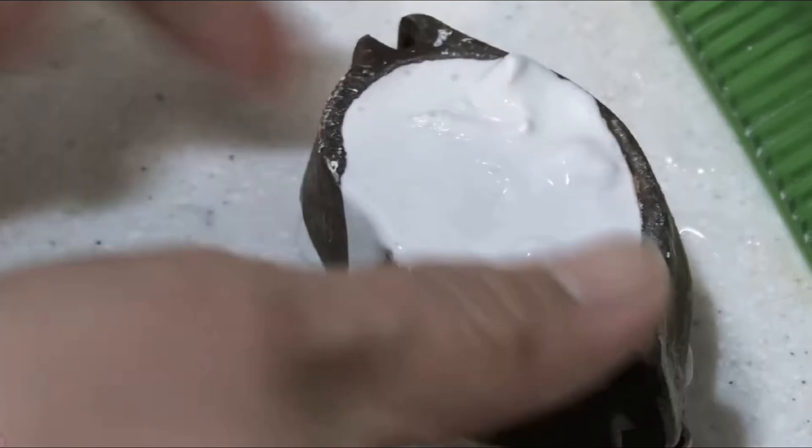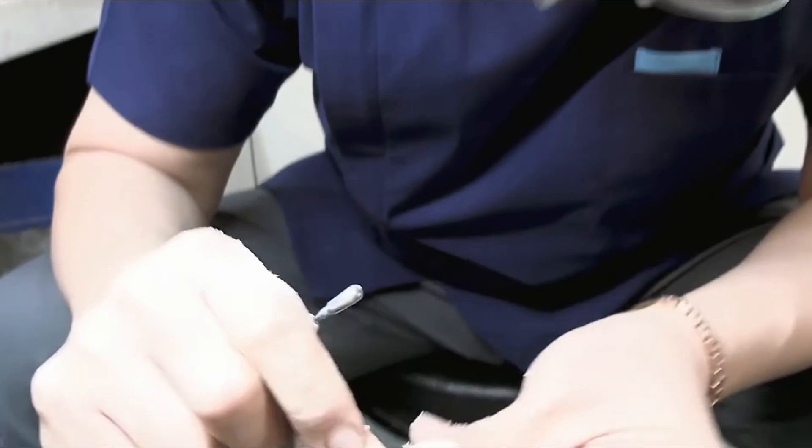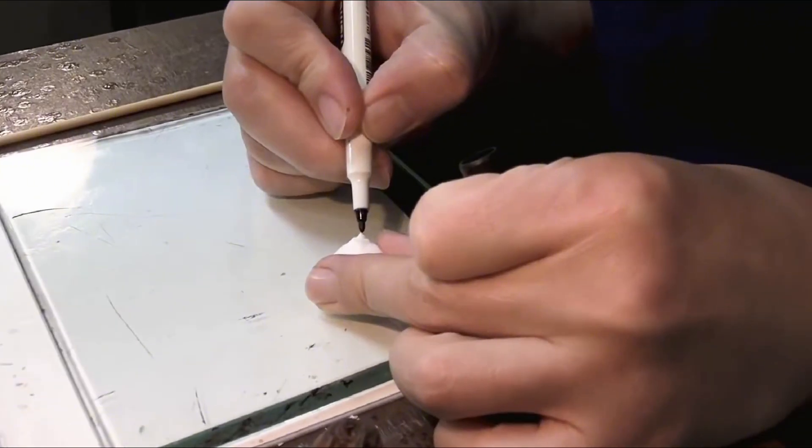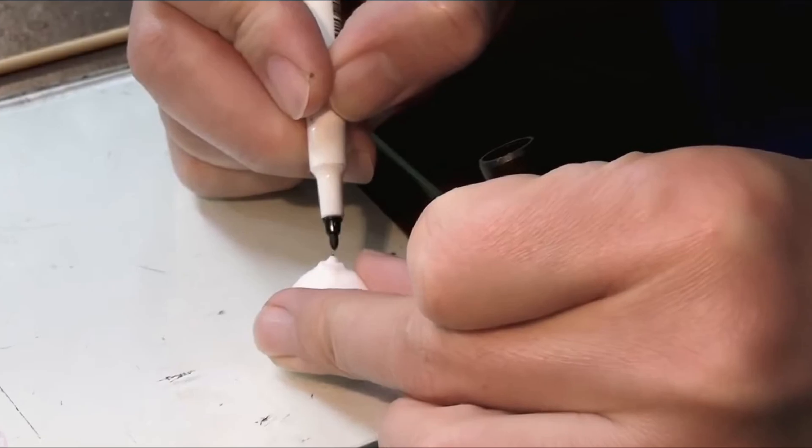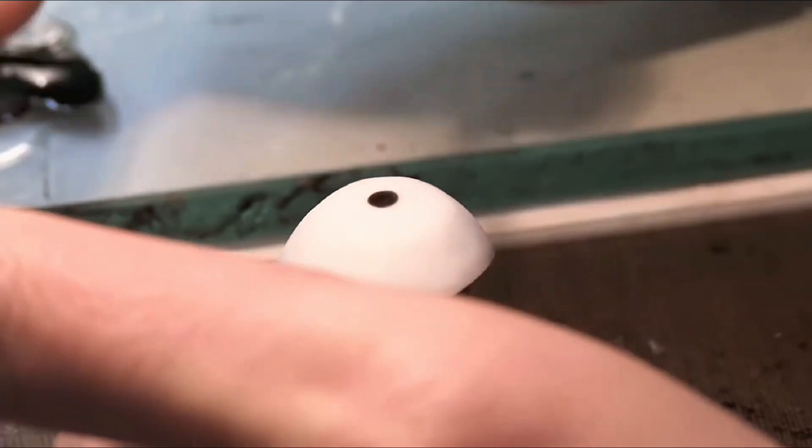For prosthetic arms, the design is tailored using a 3D model, followed by 3D printing and the integration of advanced components. Sensors detect muscle signals, enabling the user to control movements with precision. The final fitting and training sessions help patients regain functionality and independence.